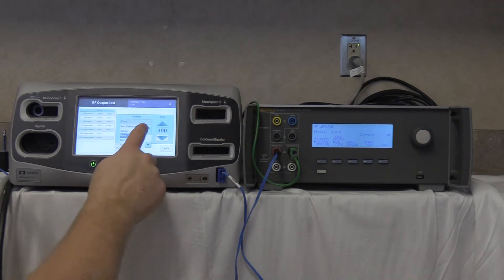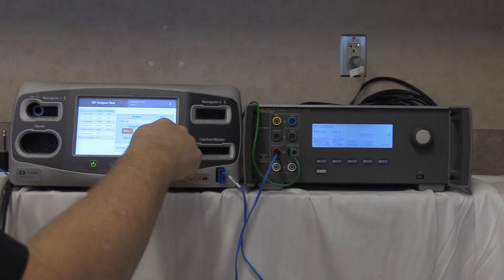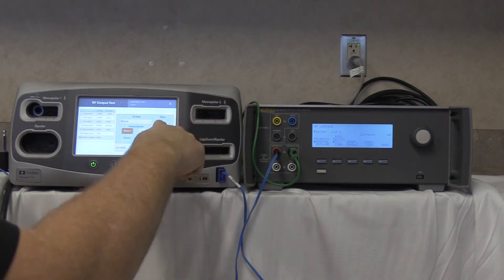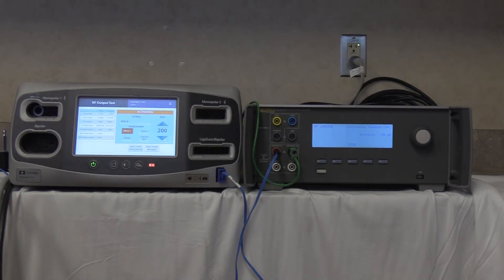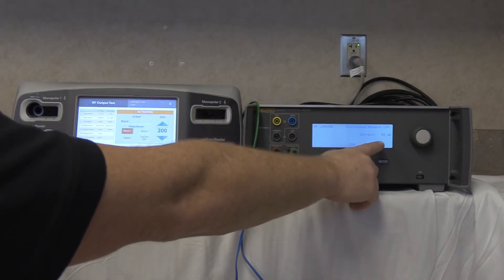Next, test blend at max setting of 200 watts. Start continuous on the QAES-3 and activate the FT10. Our reading is 54 milliamps — again below the 100 milliamp threshold.